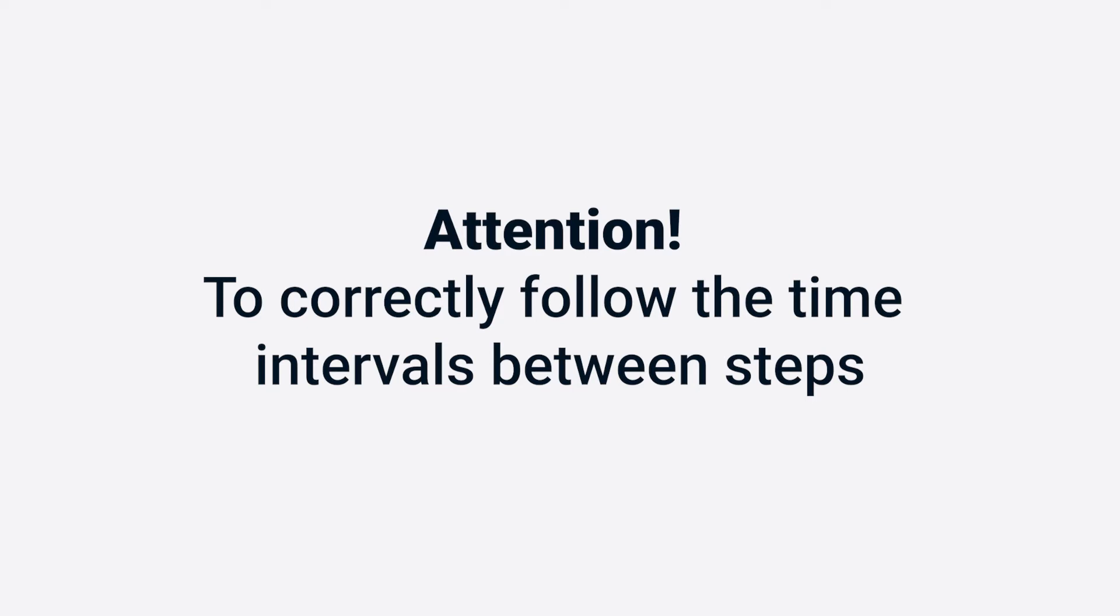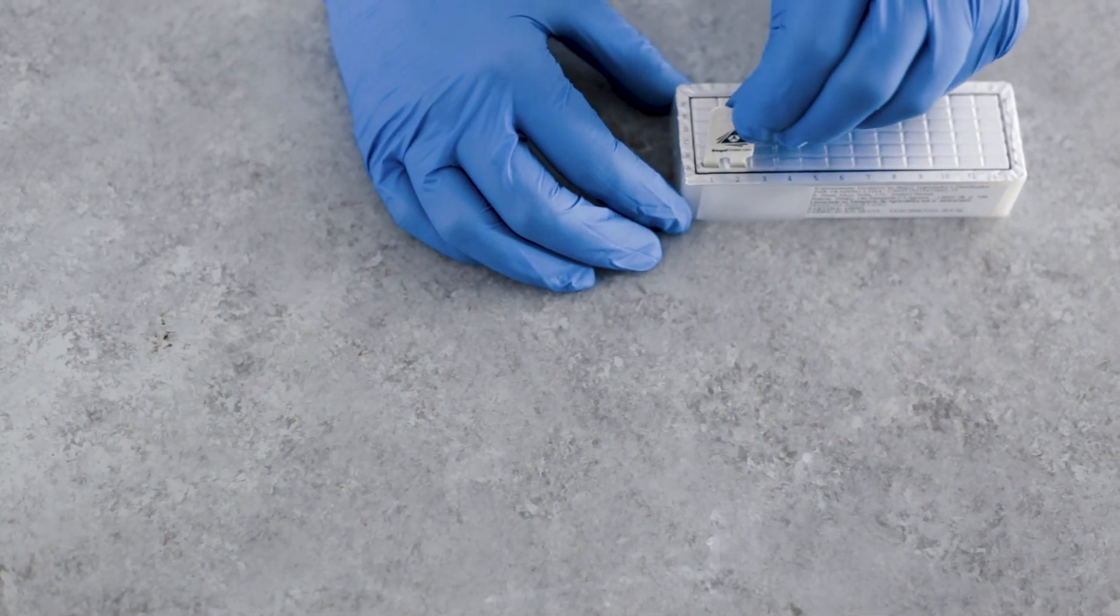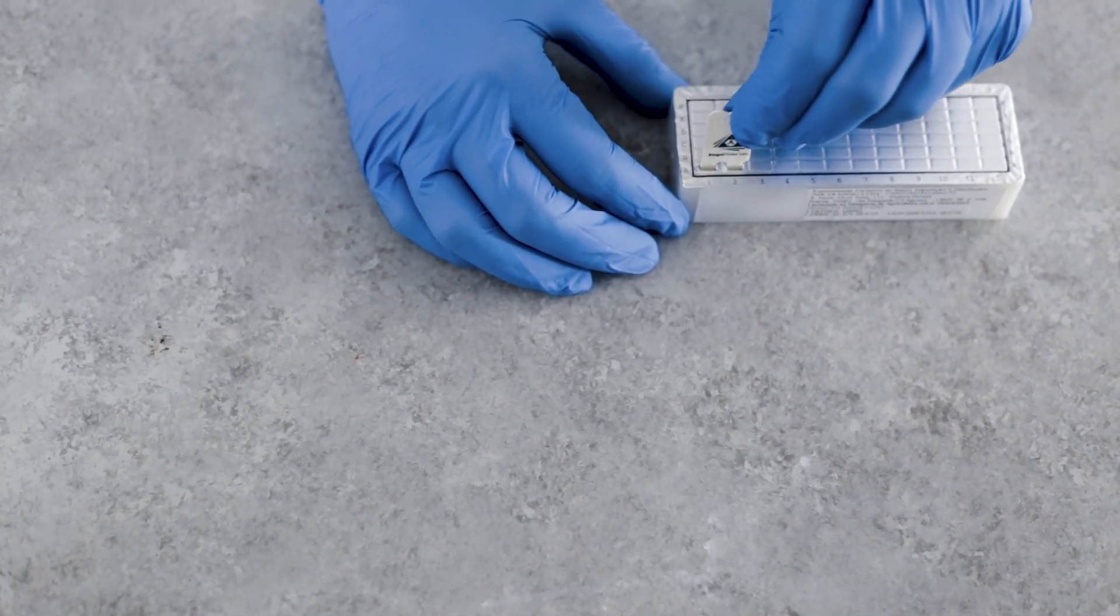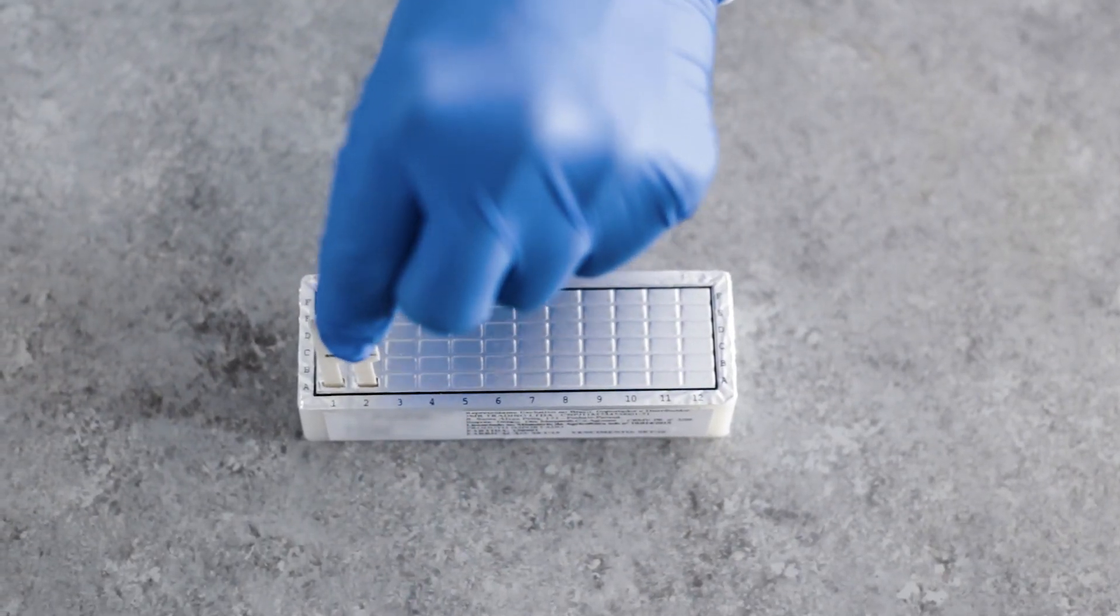Attention! It is essential to follow the correct timed intervals between each step for accurate results. Avoid scratching the front active side of the comb by leaning it to the back while mixing. Mixing during incubation is critical to achieve valid results. Repeat the mixing process 2-3 times.